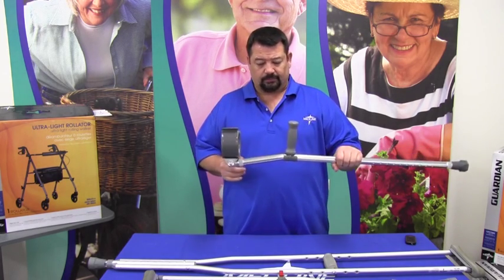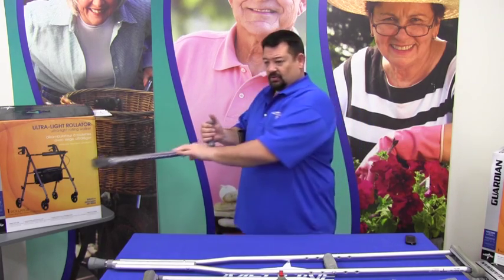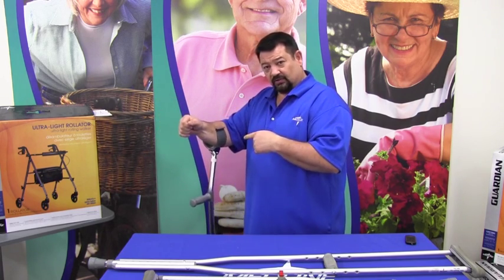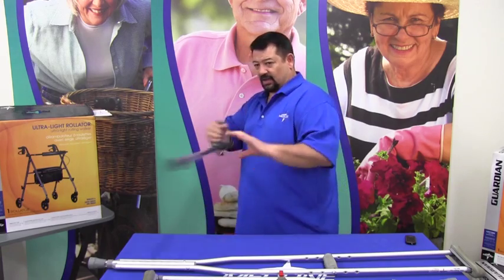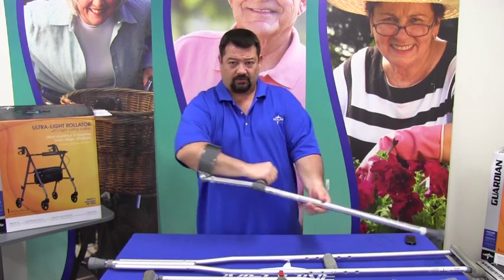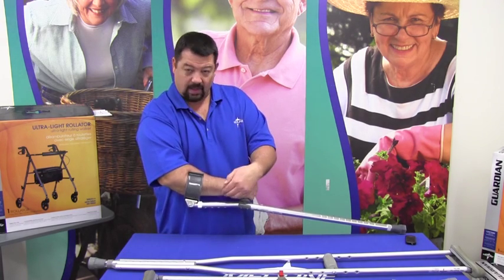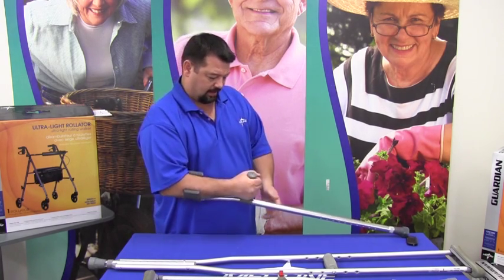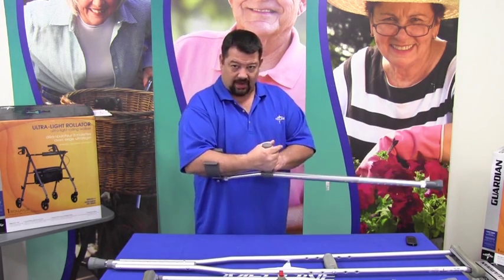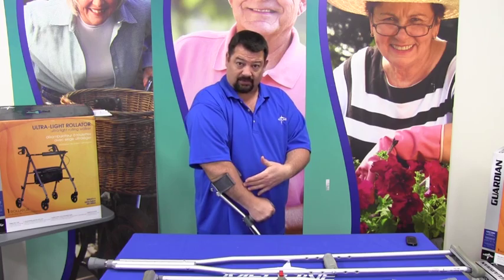The crutch itself is designed so that once it's being used, if you let it go, the crutch is going to stay on the arm. That's the reason the cuff is made the way it is. Also, the cuff on a forearm crutch is attached somewhere between the elbow and the wrist, and the necessity is that when you have your hand on the hand grip, this structure reinforces the body's ergonomic stance.